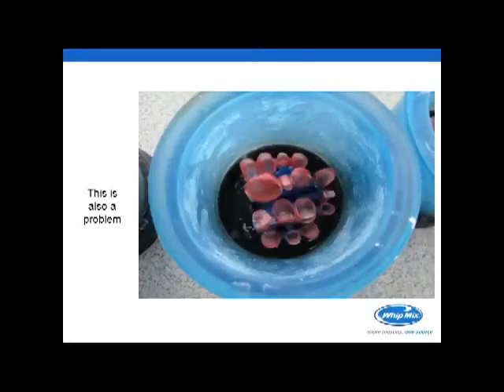All right, this is a problem too, stacking these like Lincoln logs. Now these are all over the place. The big deal on this too is that it's bridge work, and so you've got the bridges in the center of your ring that are in that heat zone and are going to retain heat longest. You've got bridges that are down lower, that were just kind of snuck in, and you've got some that are going different directions.